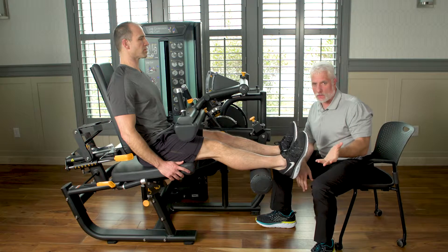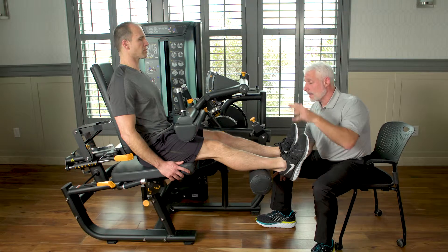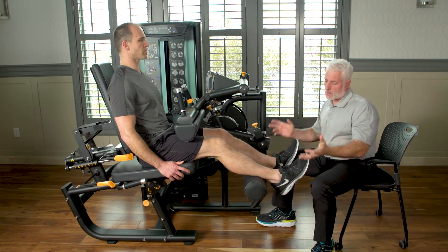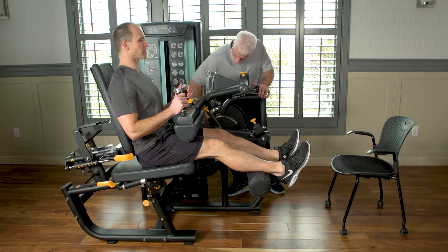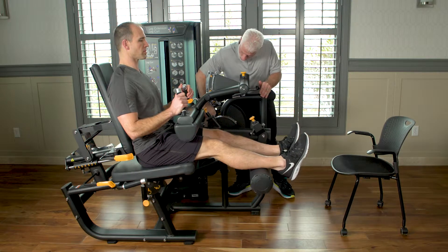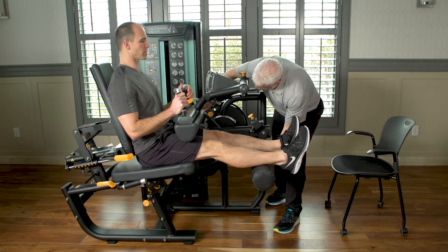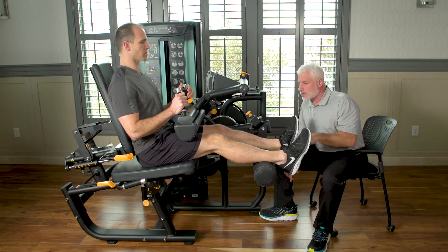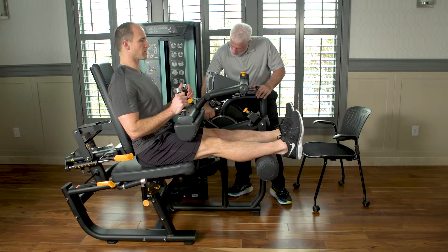With a total knee, one of the big key features is you have to gain extension. The hamstring is most efficient at 33 degrees. If the patient starts at the top and pulls down to about 33 degrees, that's your target — but they won't know that, so you use the range limiting device in the back. You can pull down, range limit, bring it back up, and repeat. I can then adjust to gain more extension by raising the range limit, doing it again, and changing it easily as we go.